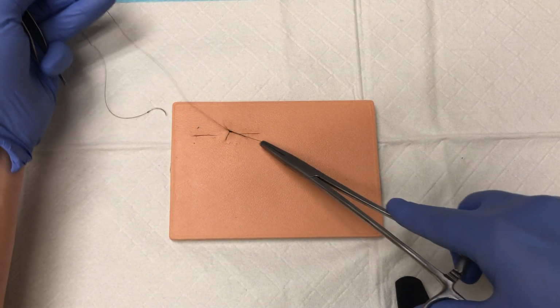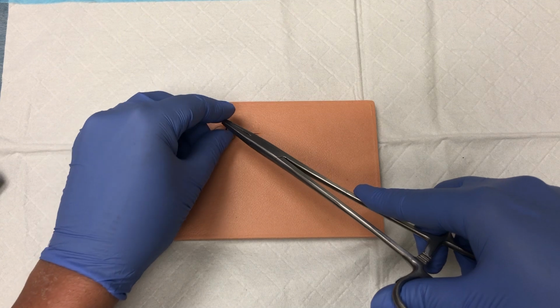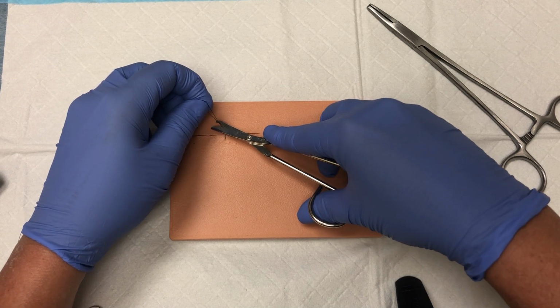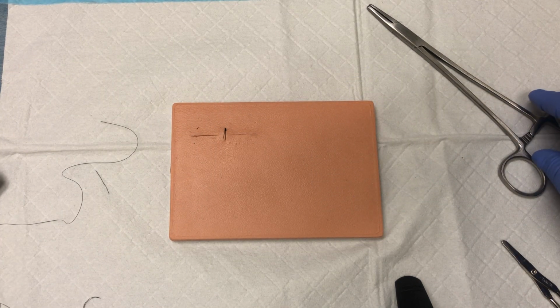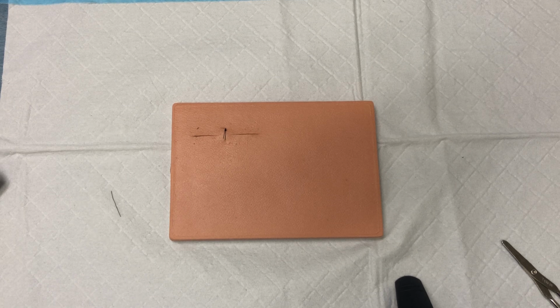and 6. Now, again, as we've demonstrated, we're going to want to cut this. So we want to come down to the knot itself, angle the hand, cut your sutures. And then you can go ahead and reload your needle for additional suturing.